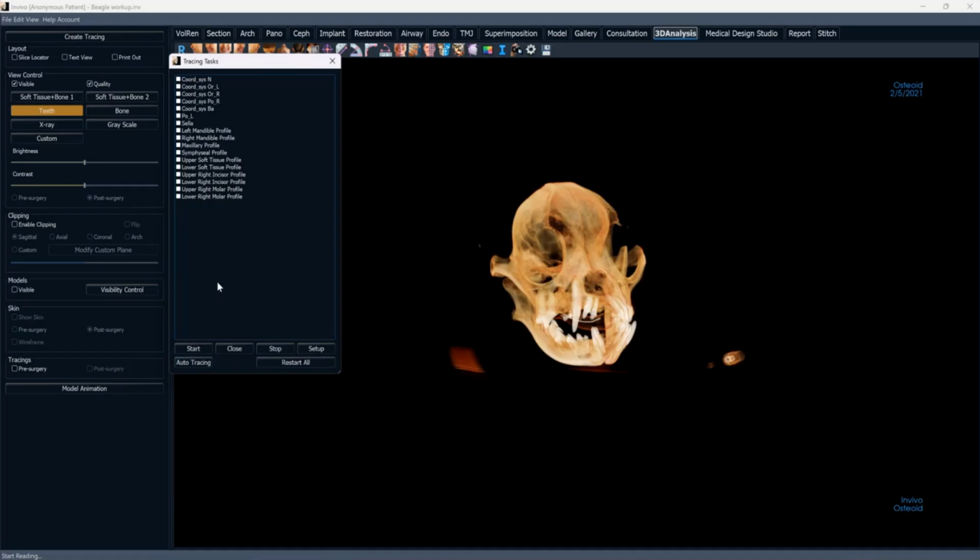And I have a mid-tier, I would say, graphics card. So even with a mid-tier, it goes very quickly. Usually about 30 seconds on that auto tracing. If you have an even higher powered CPU or graphics card, it will actually be quite quick. So that's where our AI engine currently is in play, but we'll likely see some developments to see it reach other tabs as well.